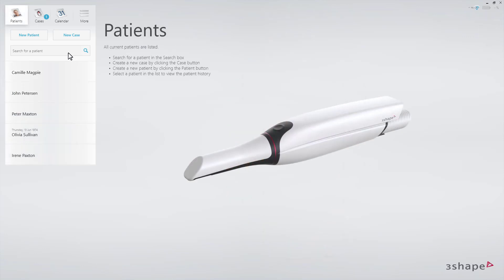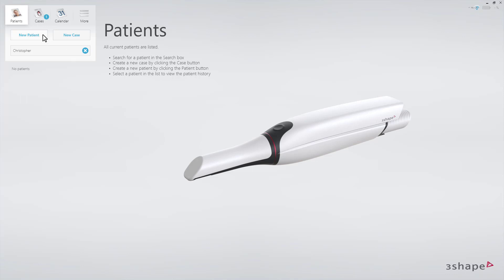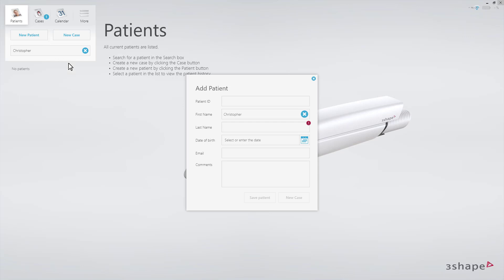If the patient does not yet exist, the search list will be empty. In this case, click the New Patient button and complete the patient registration.